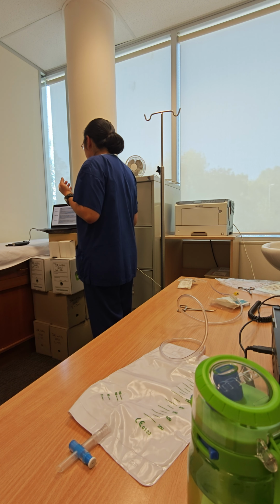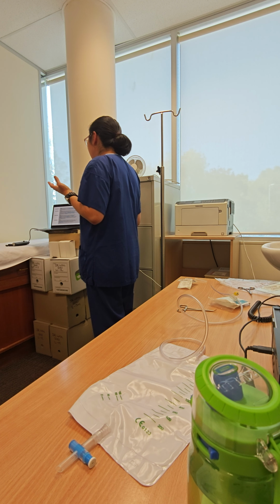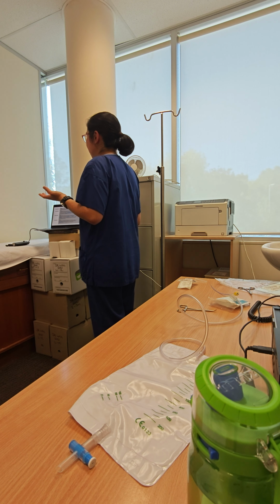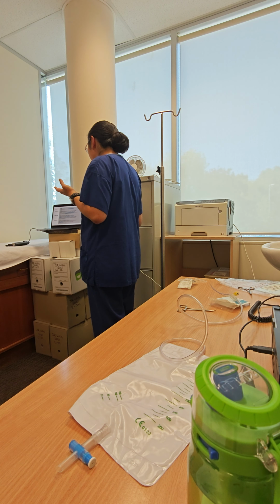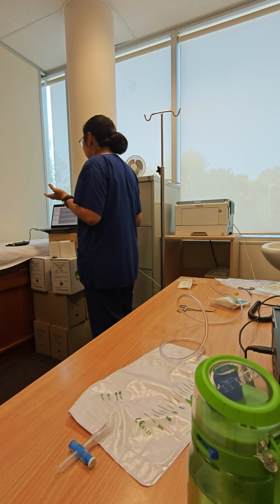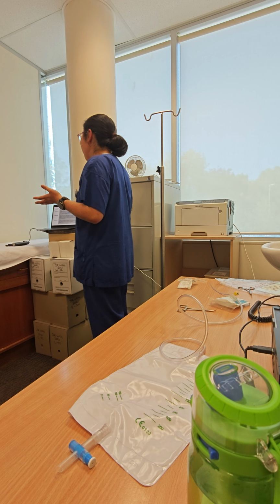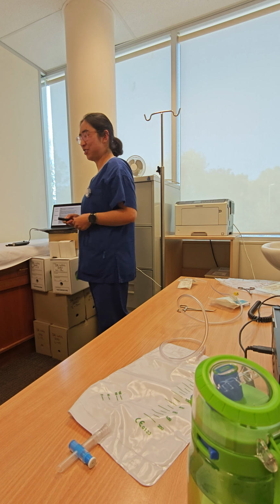The first time, the doctor said consistent with a leak. After two weeks, an ongoing leak, but it's decreased. And the third time, albeit reduced, it's persistent leaking. And finally, the fourth time, it's completely healed. So what we detected from the pictures is the same as what our doctor wrote in their report.